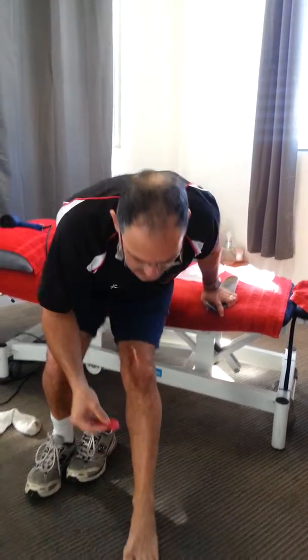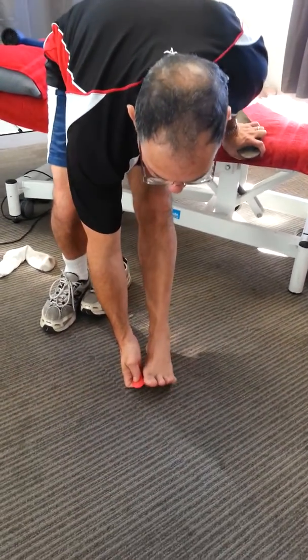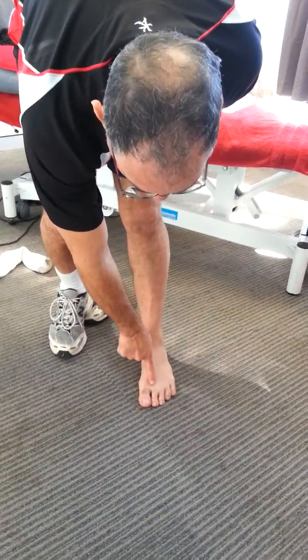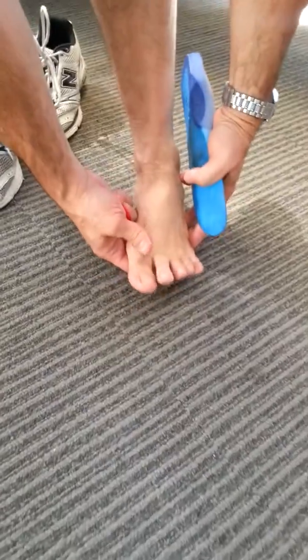This is the metatarsal dome. What it's going to do — I'm going to put it on the orthotic and it's going to sit under my foot. You may or may not be able to see, but that's flat across there. It should be supported up further.